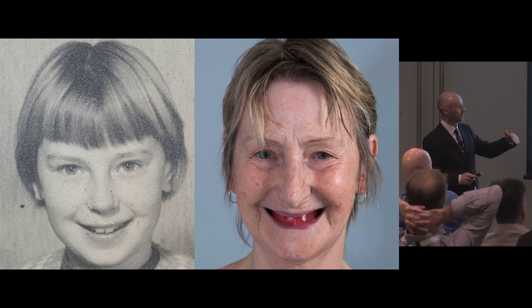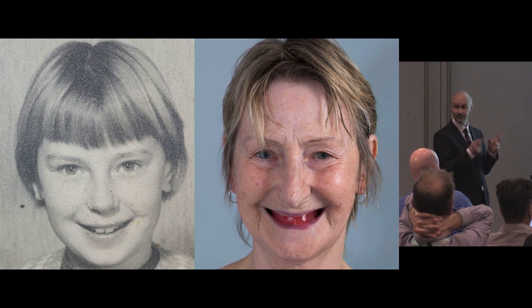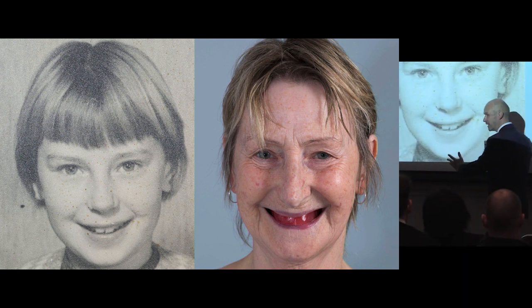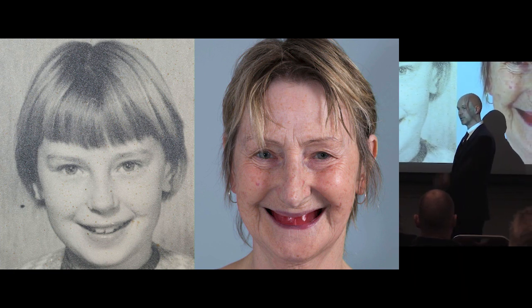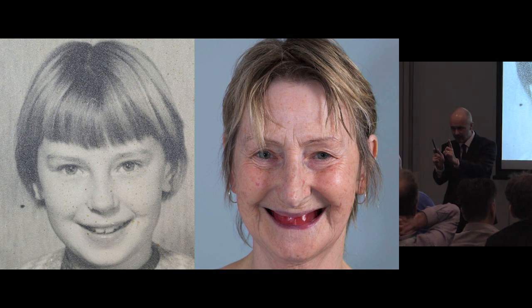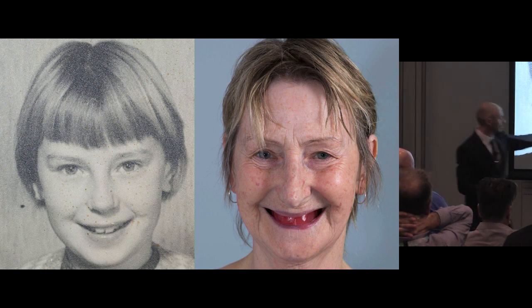Once I've carved it and got where I want to be, and Claire and I are happy, and often if I'm a little bit doubtful, Rowan will come through and have a look as well, so we get 3 eyes on the patient, checking whether it's right. I photograph the patient at the same sort of angle as the photo of them. So even if it's slightly side on, I'll get them photographed in the side on position. Rowan's got these 2 pictures on his iPad on the bench in the lab, plus that wax rim, which I've really carefully prescribed, and then Rowan sets the teeth up according to this picture.